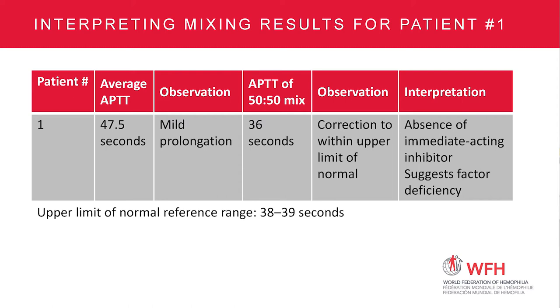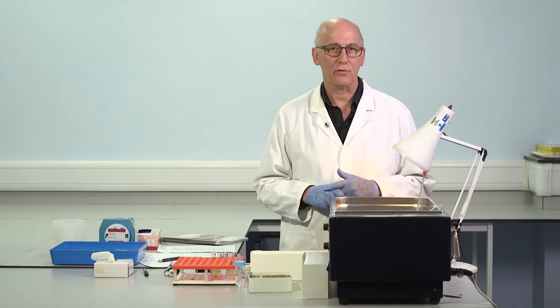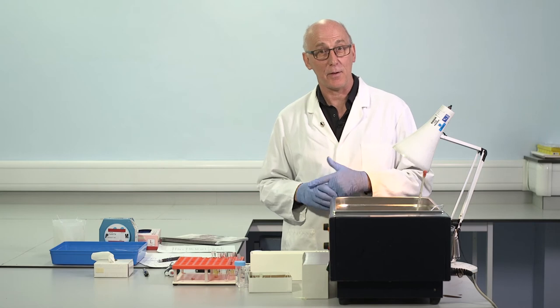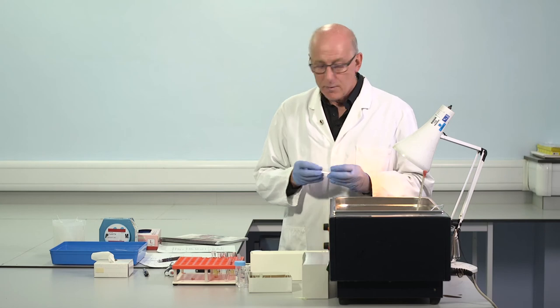So that's an indication. It confirms we do not have an immediate acting inhibitor. We don't have a lupus anticoagulant. It's more likely that we're dealing with deficiency because we've got a full correction back into the reference range. And that might shape our next investigations. I think in this case, we'd look at the patient's history, of course, and be influenced by this, but we might then move into specific factor assays on this patient. We'll talk some more about this question of incubated mixtures. Patient number two.